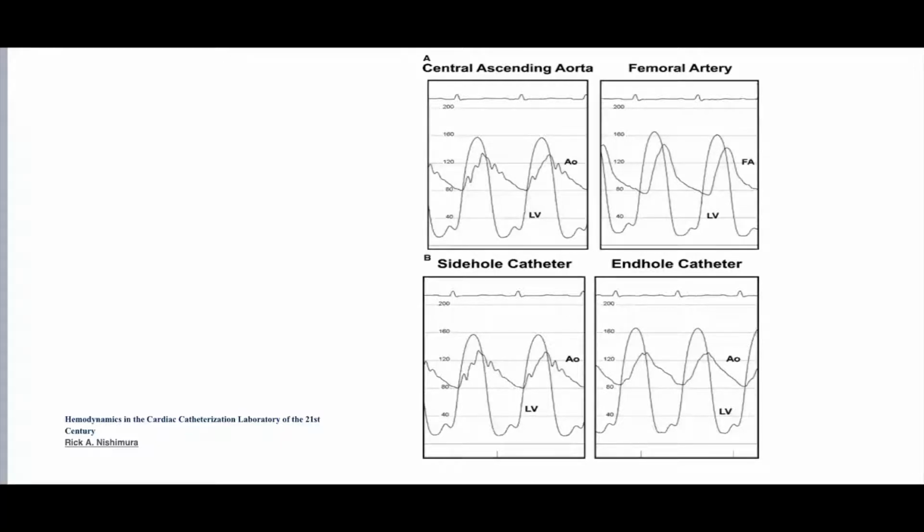But sometimes it can be overestimation. If you use a femoral catheter, it might lead to overestimation sometimes. Do you have any patient with sclerotic disease? Exactly. If you have femoral artery stenosis and you are checking there, the pressure will be lower than it should be. So in this case, you are overestimating. So the femoral artery mostly leads to underestimation, but it can well lead to overestimation if there is femoral stenosis by atheroma or atherosclerosis.